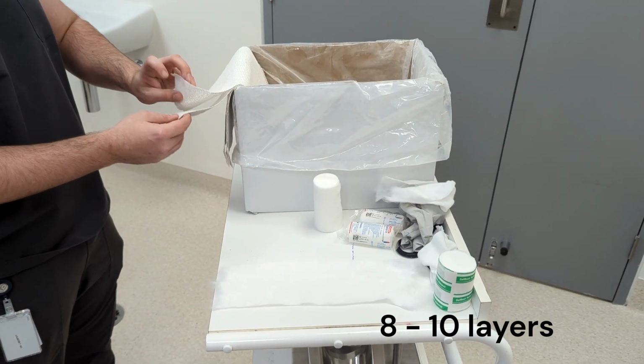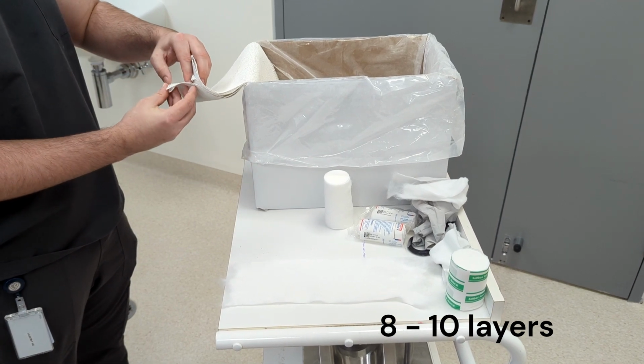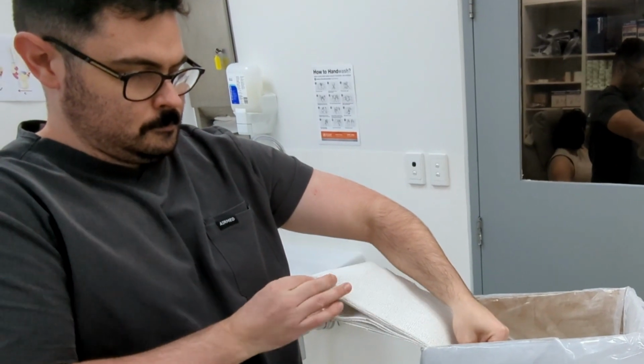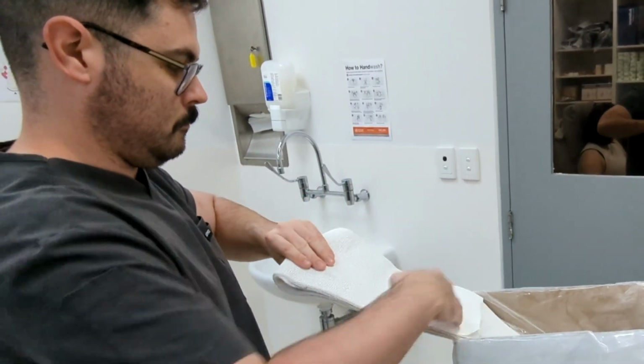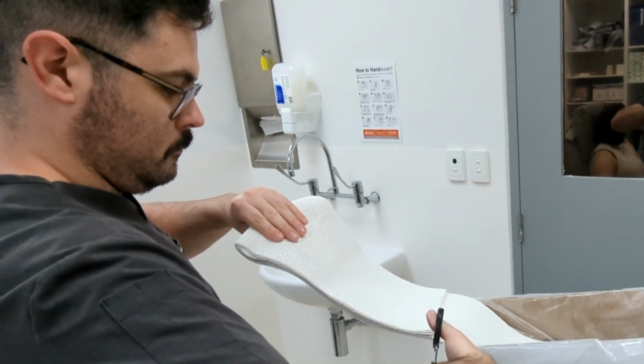Firstly, you need to count the amount of layers you need of plaster of Paris, which is usually 8 to 10, and each stack has 5 layers. Using the pre-measured soft band to measure out the length of plaster of Paris required, you then fold it in half, making a layer of 10, and cut to length.